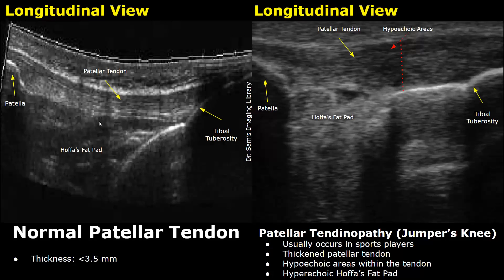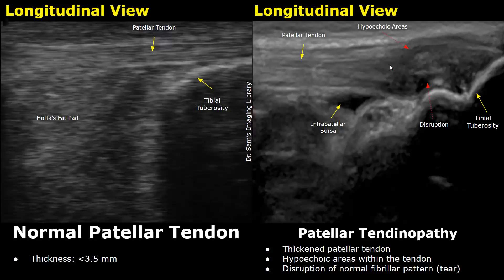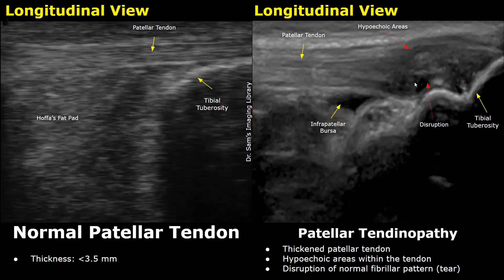Here is another image of tendinopathy. The tendon is thickened; this is the affected area. It has hypoechoic areas as well as a small disruption. This anechoic area represents a tear, and there is edema and fluid collection which makes this affected area hypoechoic.